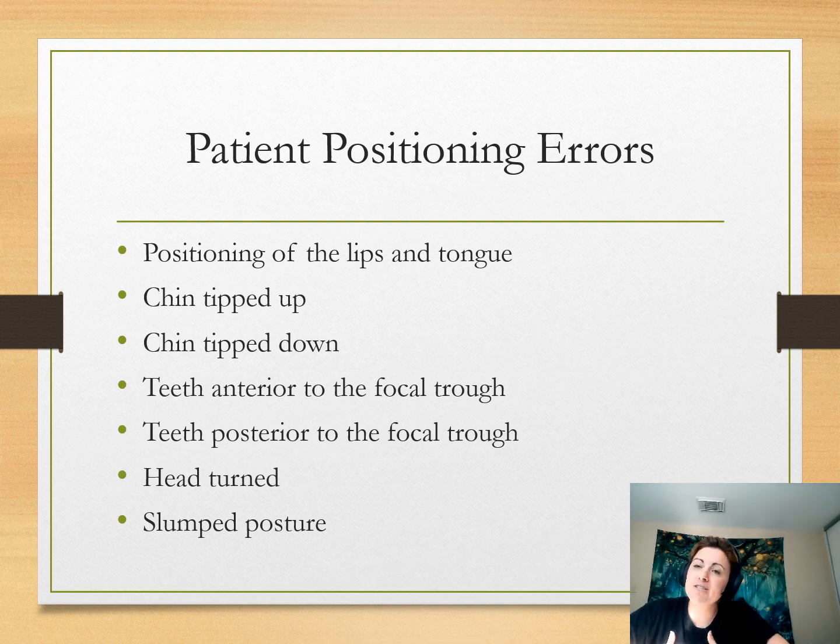Now, posterior teeth can sometimes be difficult. What happens is that if you don't get your mid-sagittal plane perpendicular to the floor, they'll be tilted a little bit side to side, right? And you don't want that. Sometimes patients have neck problems and they just can't quite get in there. They're permanently crooked. I'm a little crooked, you know, so you just do your best.